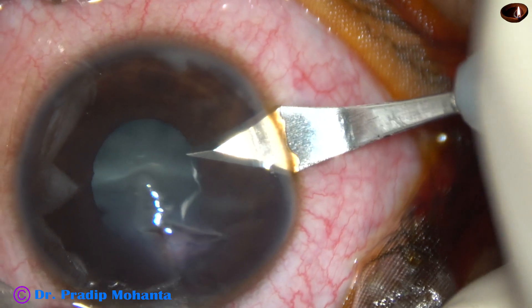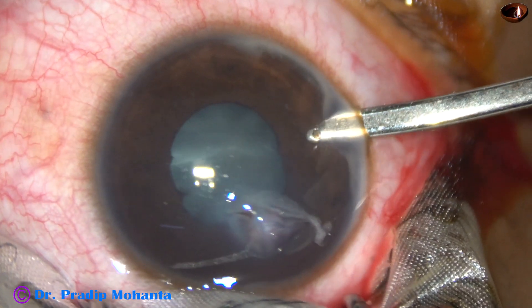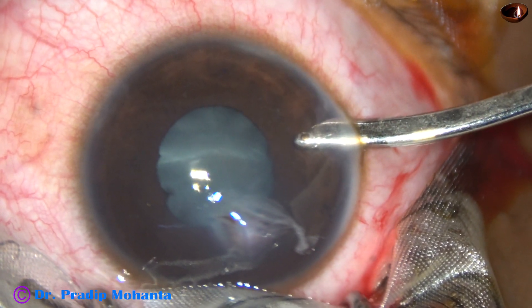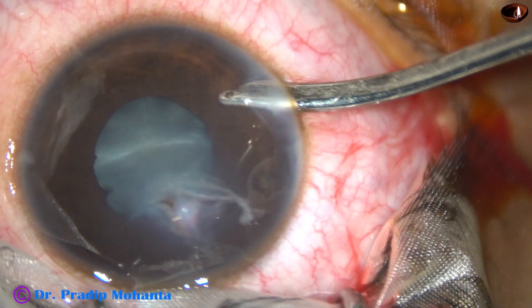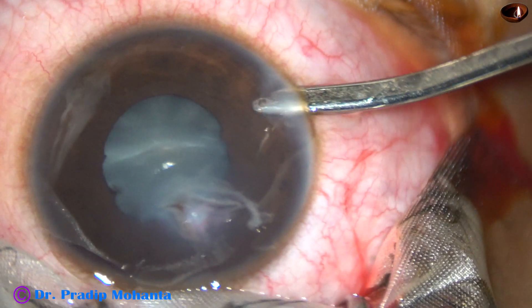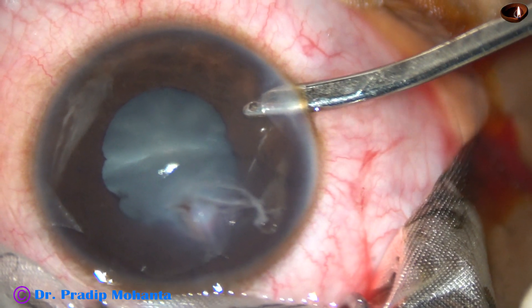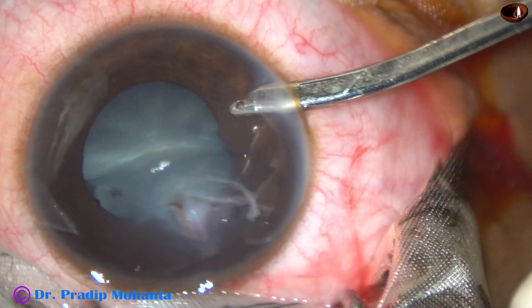This is a side port at 9 o'clock and now I am using a 23-gauge Simcoe cannula for anterior chamber lavage. You can see some milky fluid settled at 6 o'clock is coming out through the Simcoe cannula. Now the anterior chamber is quite clear, and the pupil is dilating because of adrenaline in the BSS.